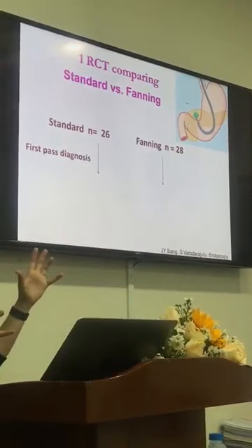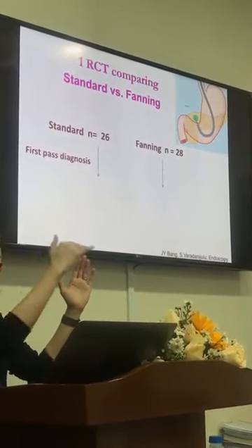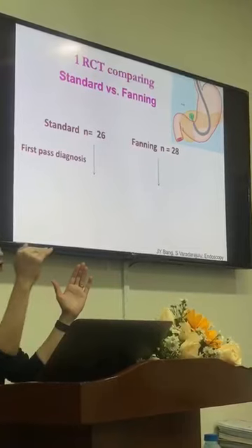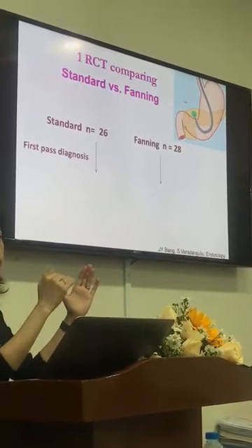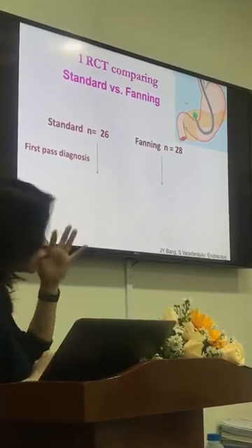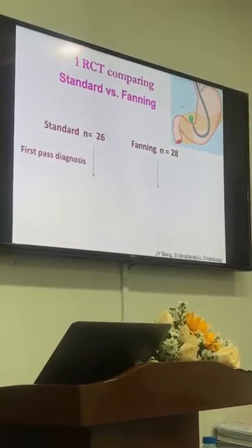different quadrants. And you basically aim your needle trajectory to these 4 different quadrants, but you would do 1 quadrant at a time. And each quadrant you would push the needle in and out basically to and fro 4 times. So 4 times each quadrant, total of 16. Okay, that's the conventional or original description of fanning technique.